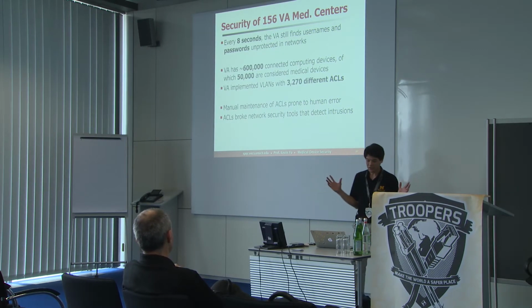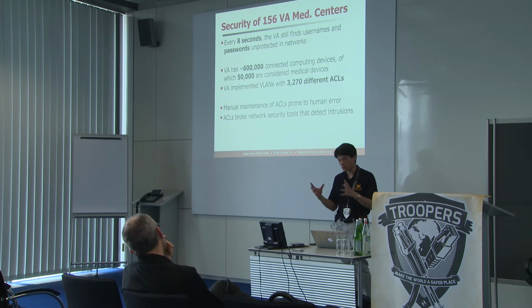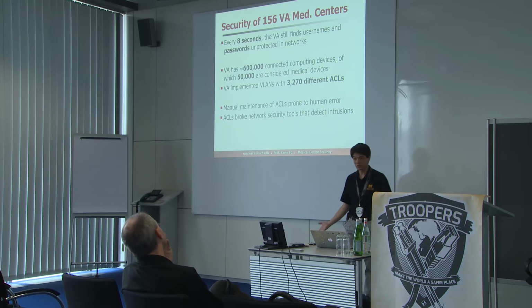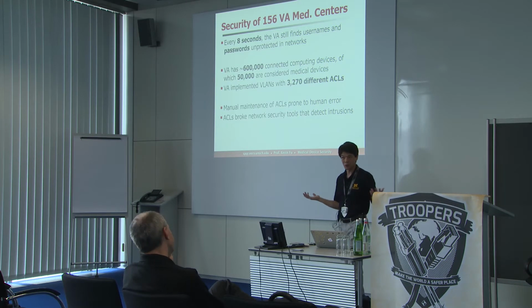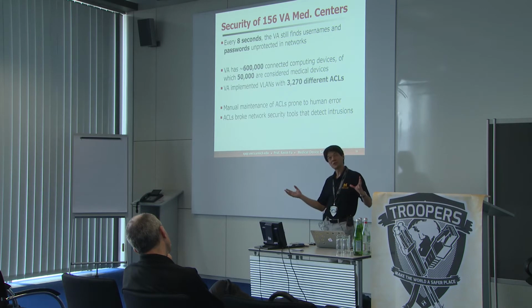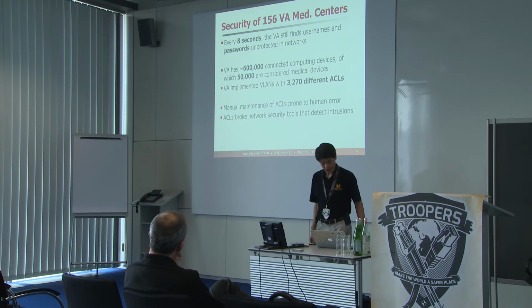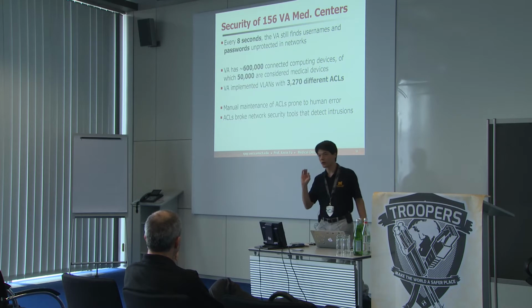But to deal with this whole mess, they have about 600,000 computers, of which about 50,000 are actual medical devices. And the only way they've been able to preserve the security at all is to create a ton of virtual LANs. So think of it as virtual firewalls. But one of the side effects is their intrusion detection software no longer works on the things they protected. So when they come back and they see that nothing's infected, well, that means nothing on the outside is infected. So they've lost a lot of insight into what's going on, and it's also very prone to human error. There have been instances where a manufacturer, just for a split second, opens up a port on a device to do a software update, and then malware gets in.